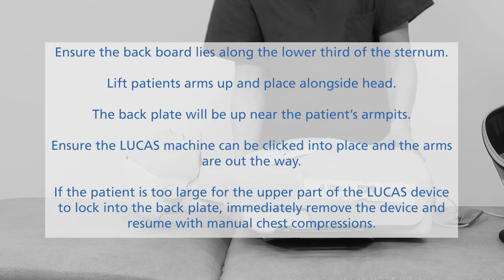Ensure the backboard lies along the lower third of the sternum. Lift the patient's arms up and place them alongside the head if possible. The back plate will be up near the patient's armpits. Ensure the Lucas Machine can be clicked into place and the arms are out of the way.